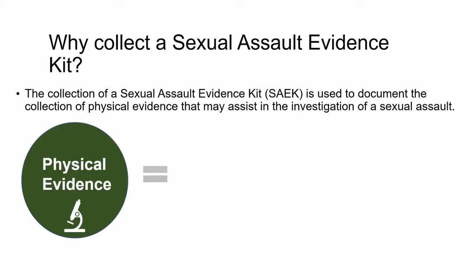Sexual Assault Evidence Kit Collection. Why collect a sexual assault evidence kit? The collection of a sexual assault evidence kit is used to document the collection of physical evidence that may assist in the investigation of a sexual assault.